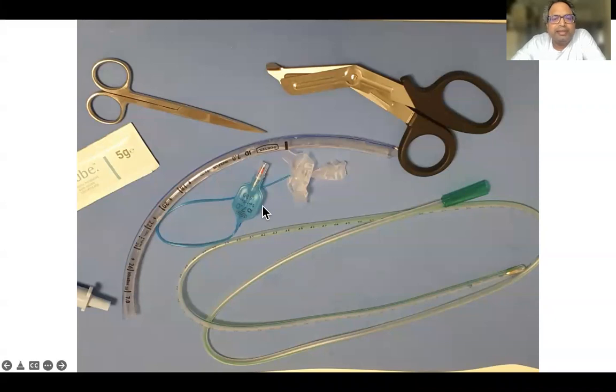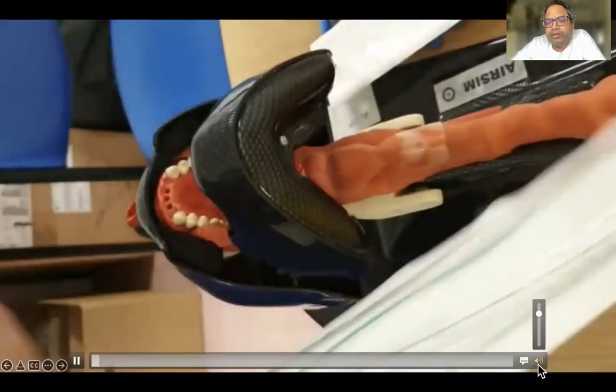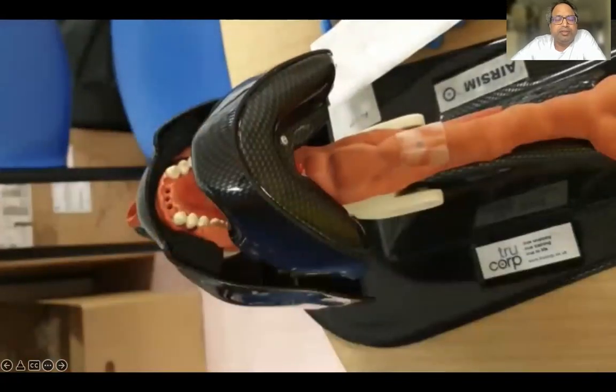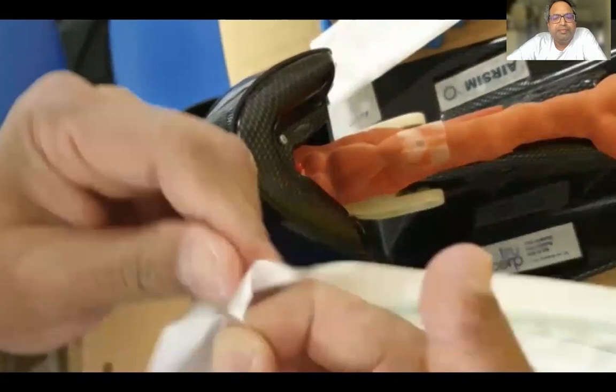So here you can see there's a split tube. I have detached the cuff, the pilot cuff, and the cuff itself, which has been taken out. There's some jelly and various things which we actually need. And now I'm going to demonstrate how the whole procedure is done. So we're going to take the NG tube and insert it through the nose in a minute.